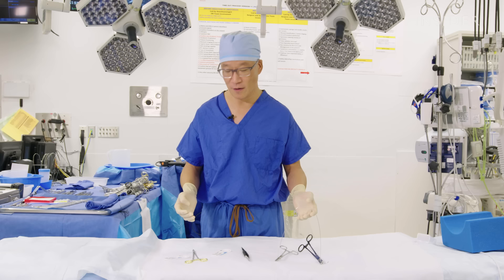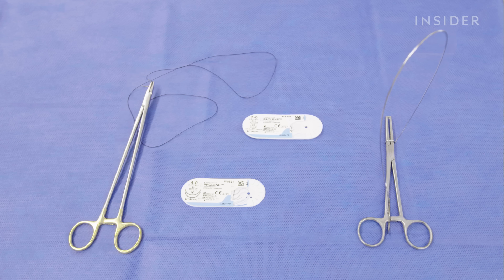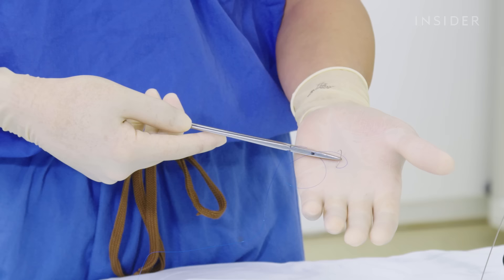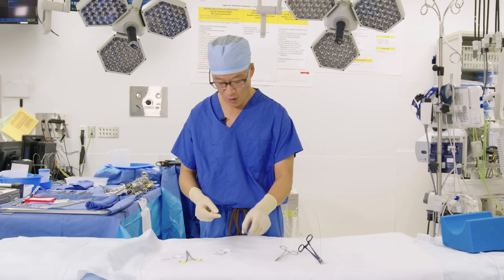We commonly use sutures during the course of our operation — we often use up to 50 or 60 different types of sutures, but these are some of the more common ones. This is Prolene. Prolene is what's referred to as a monofilament suture and is permanent, staying in the patient's body forever. This is what we use to sew onto vessels like the aorta to hold things in place.